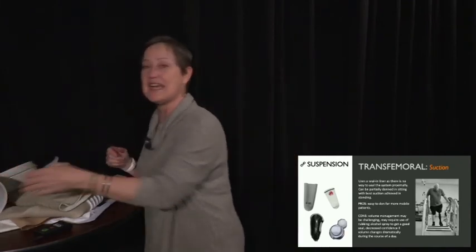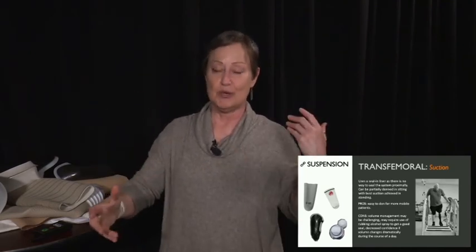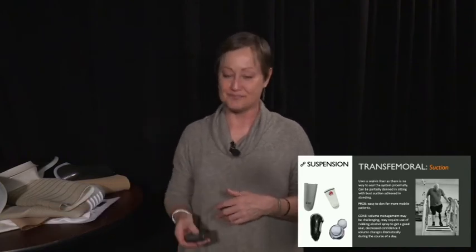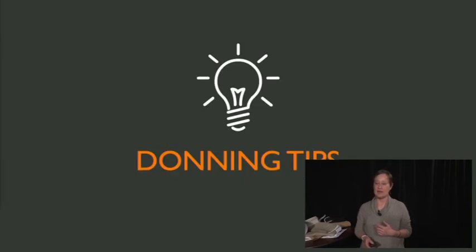As soon as you take off the socket, in order to doff the socket, you take the valve out, break suction, you pull out, and put the valve back in right away so you don't lose track of it. So that's suction for the transfem patient. That kind of gives you your overview.